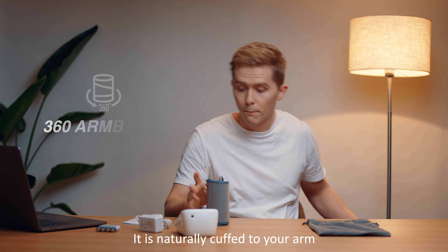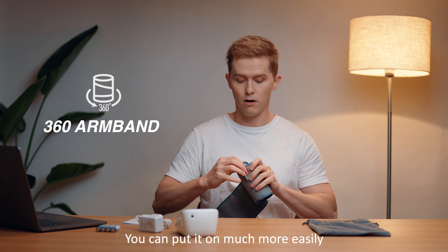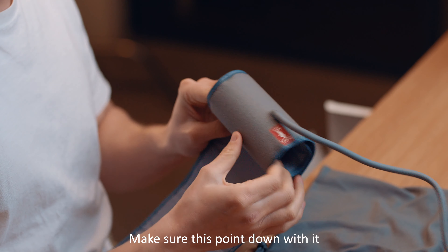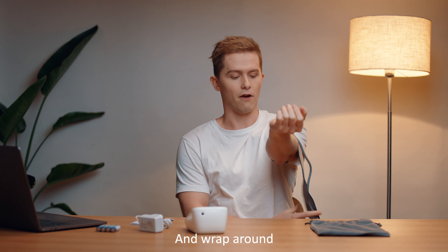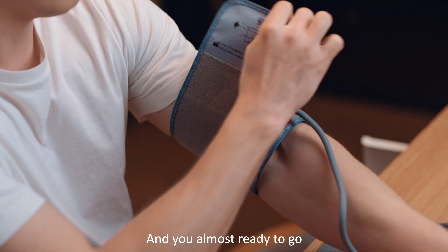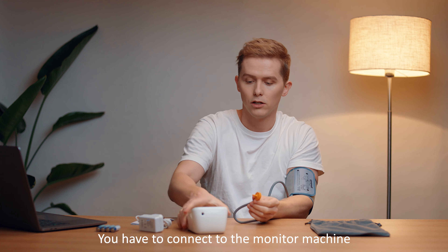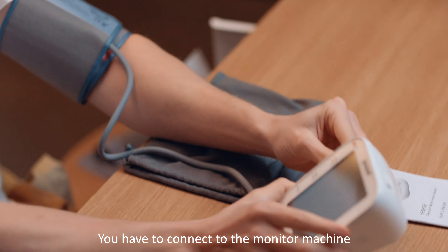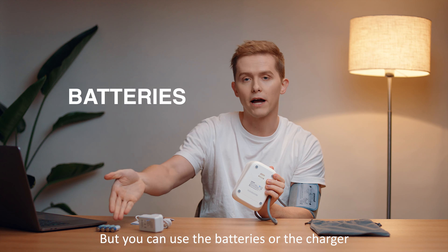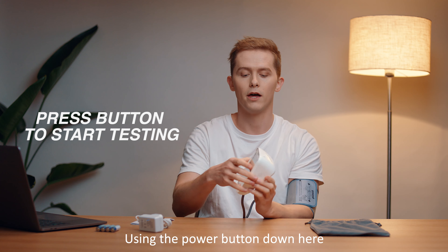With this monitor, because it's naturally curved to your arm, you can put it on much more easily. Make sure it's pointing downwards, put it on like that, and wrap the velcro around. Then you connect it to the monitoring machine. You can use the batteries or the charger.